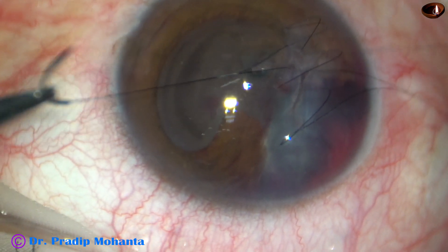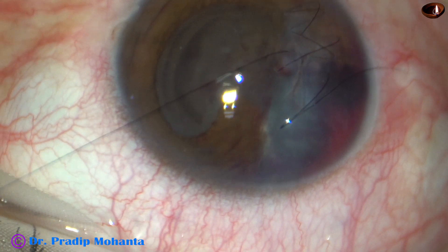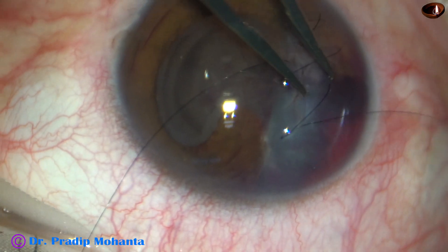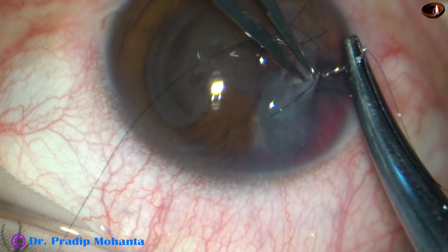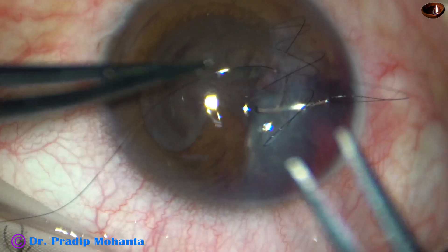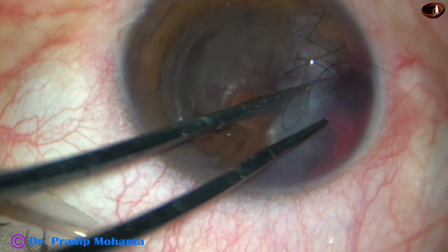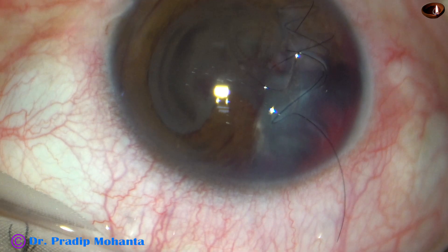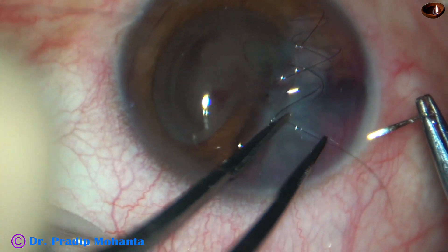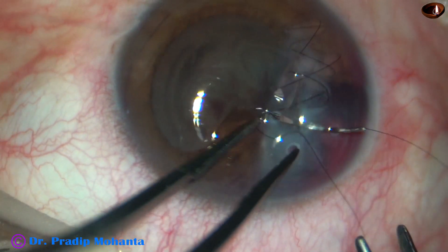This is a totally unedited surgery from beginning to end, and you are watching each and every point of the surgery. This is the last-but-one bite. I hope this patient will get good vision because the wound is not exactly at the center of the cornea — it is eccentric. Now see the last bite: it comes from the right leaf to the wound and then comes out.